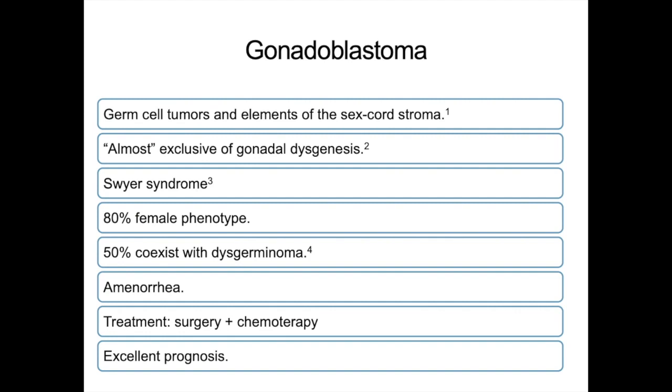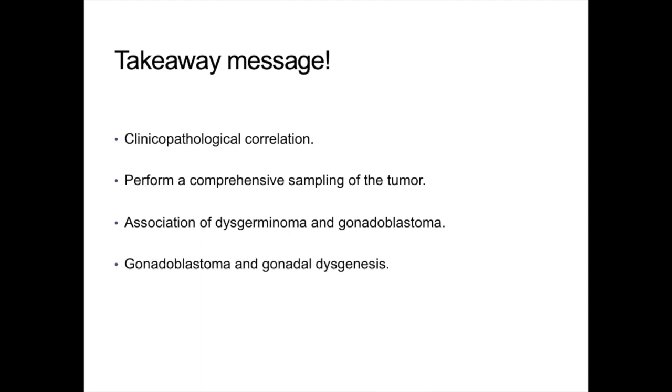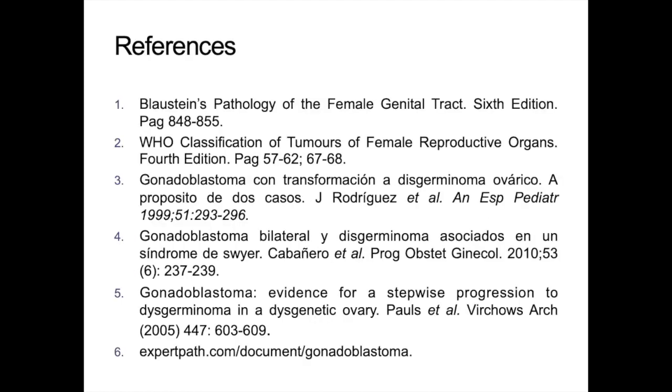The last slide is just a take-away message. Don't forget always the clinicopathological correlation. Perform a comprehensive sampling of the tumor, the association of dysgerminoma and gonadoblastoma, like in this case, and gonadoblastoma and gonadal dysgenesis is almost, but not totally, exclusive.